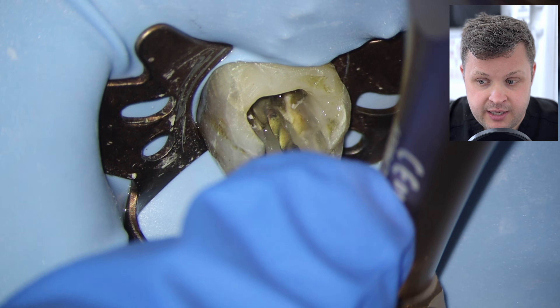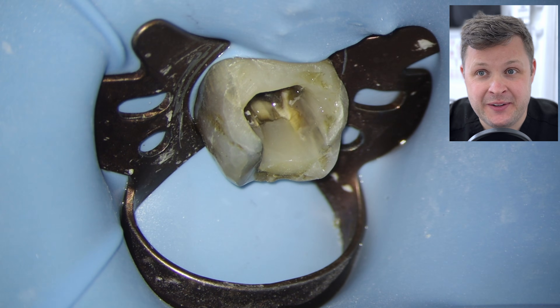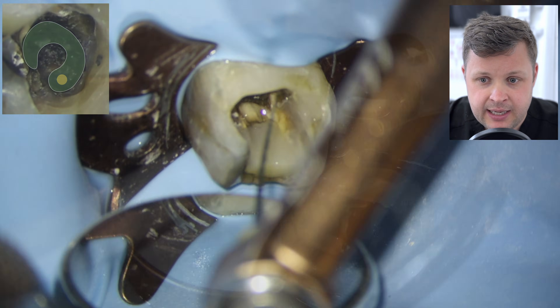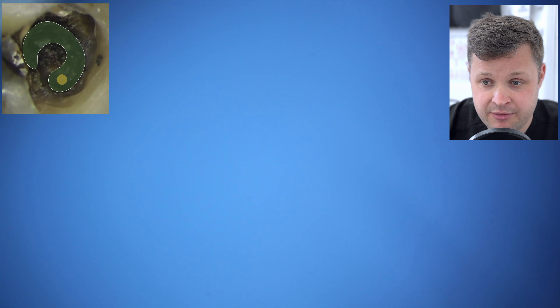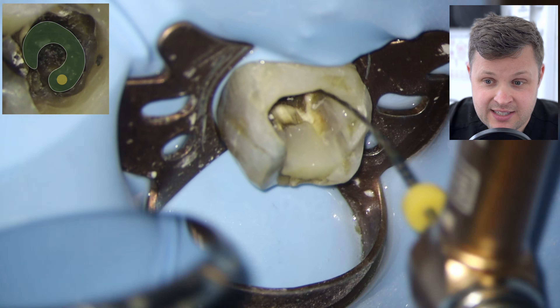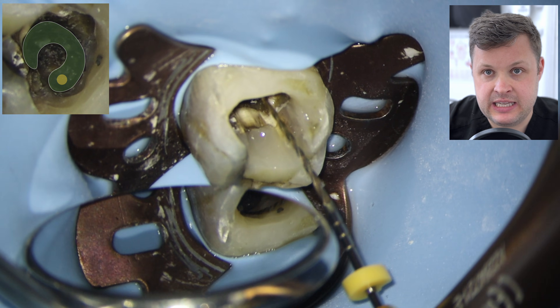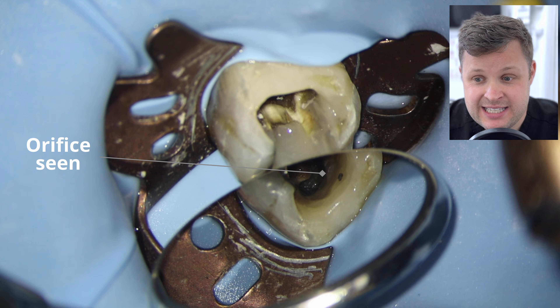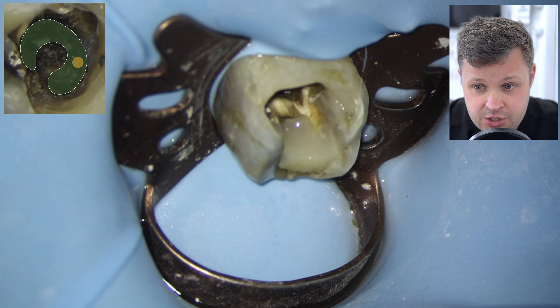I use the size 25 in a reciprocated motion until I reach working length, then press another button to switch into rotation to shape the canal out. Now looking for the mesiobuccal canal — the most obvious one seen on the CBCT shown in the top left corner. Using lots of irrigation with the HyFlex 15 and a size 10 K-file, I just could not find this orifice. While irrigating and using ultrasonics, I actually found the mesiolingual canal instead.